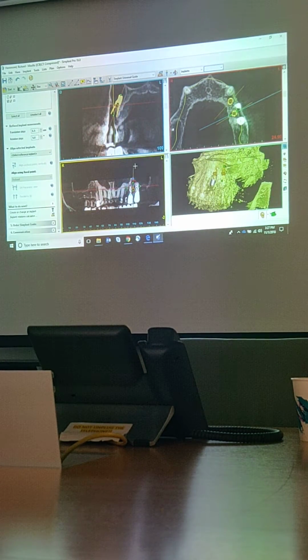But let's say we have our implants where we want them. The next step would be saving the case and uploading it to Dental Planet. So let's go through Dental Planet right now, so you guys can actually see how we're going to upload it.